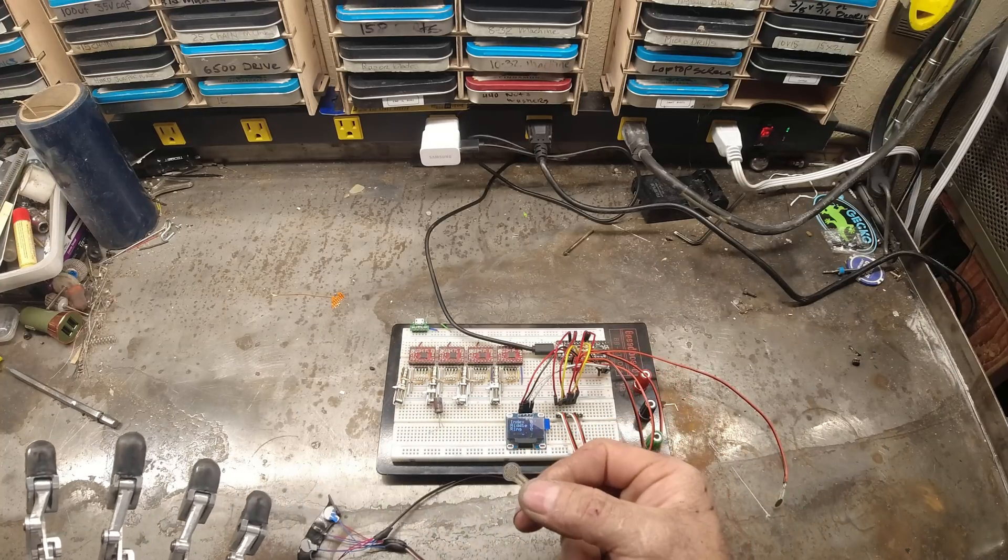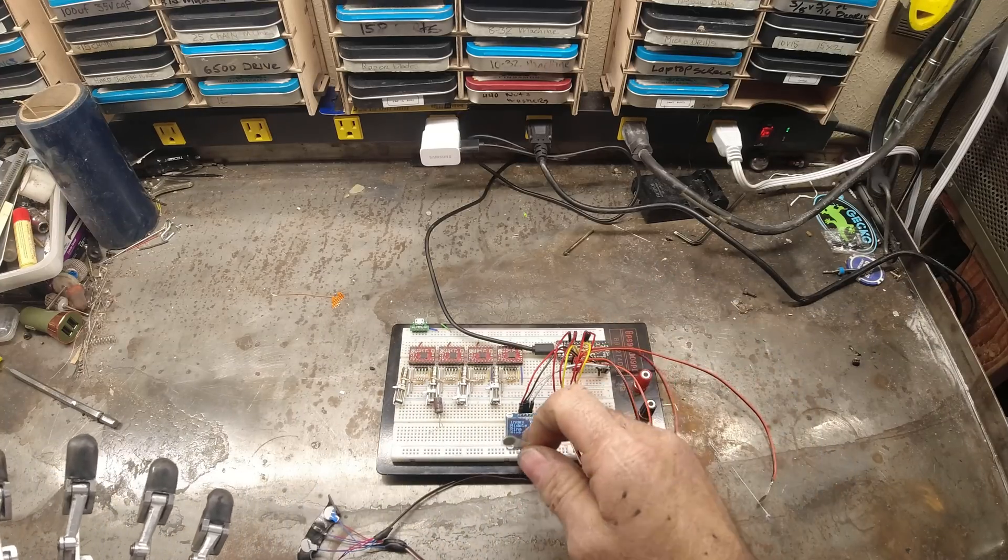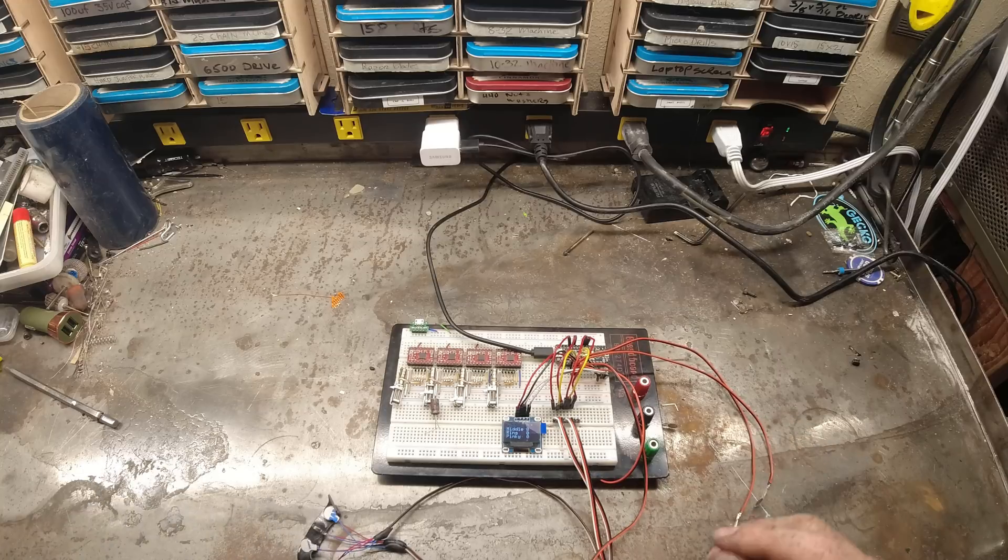The components for this build are four FSRs, a Metro Mini, a display, haptic motors, and a battery pack.